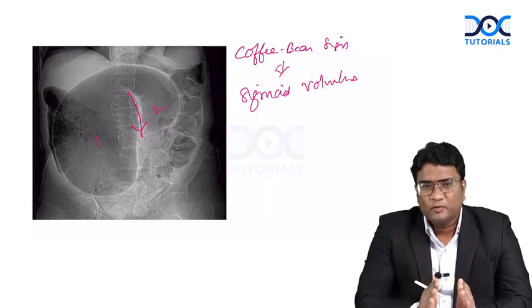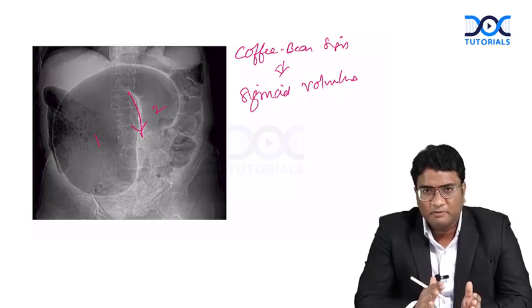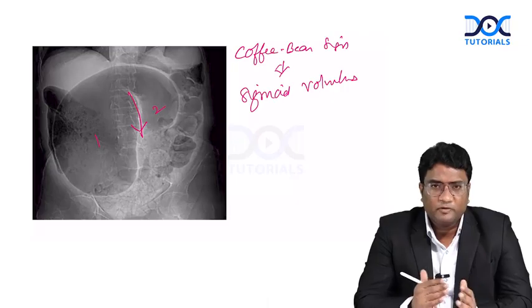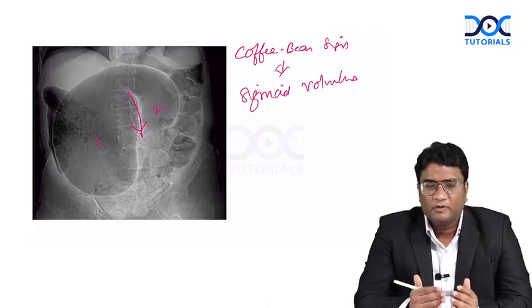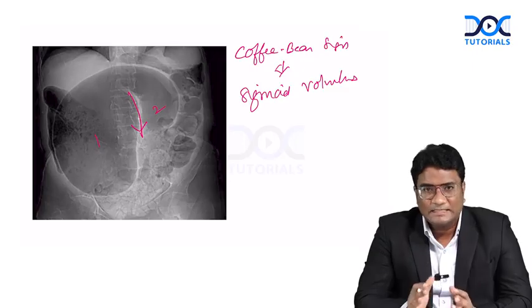So with this, we complete some important chest radiographs. I have covered some important emergency abdominal radiographs, how to look at intestinal obstruction, small bowel obstruction, large bowel obstruction, sigmoid volvulus, and how to identify hollow viscus perforation or pneumoperitoneum when you see air under the right hemidiaphragm. Now let's look at some CT scan images.